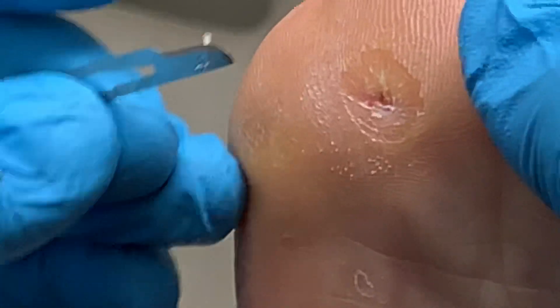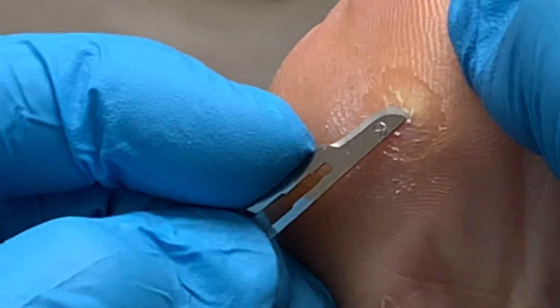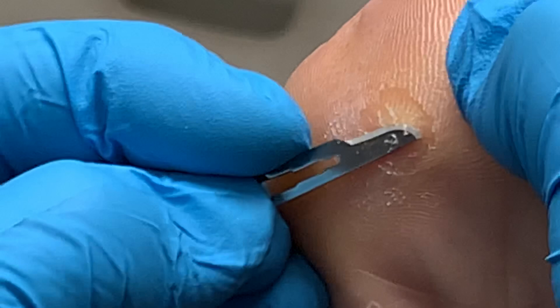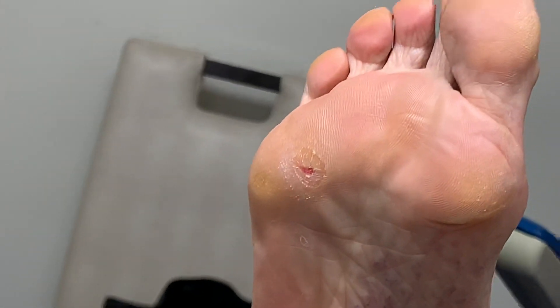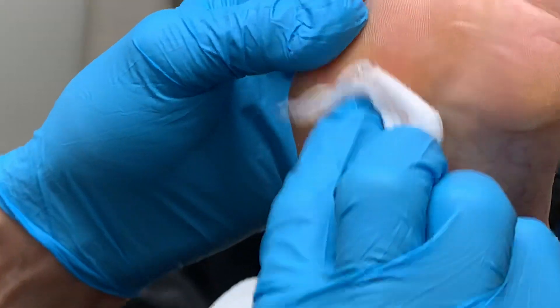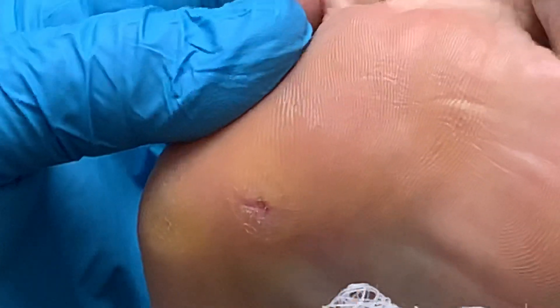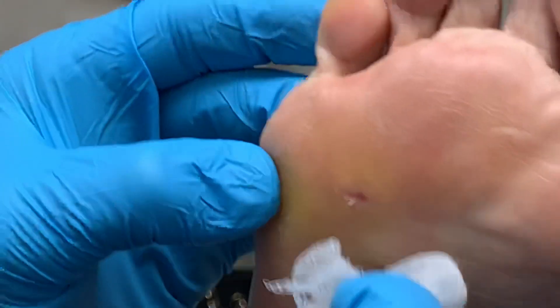We're almost going to stop here — just a little bit more. Let's get a little bit of alcohol there and clean up a little bit to see what we've got. A little bit better? I think so — I think it looks really good. I think she's got another one here and here, but I'm not really concerned about that right now.